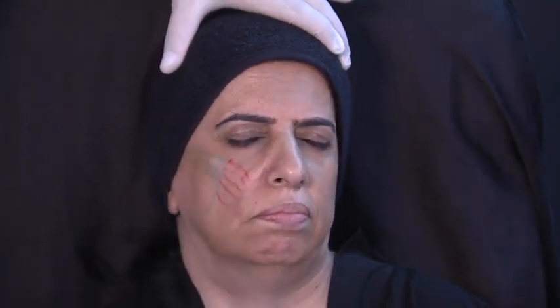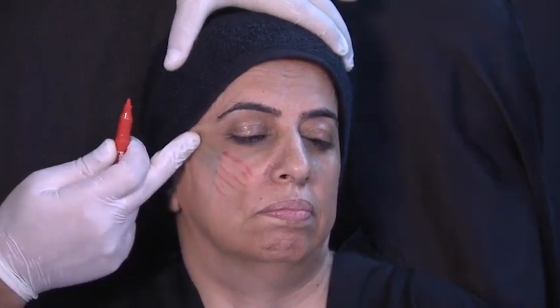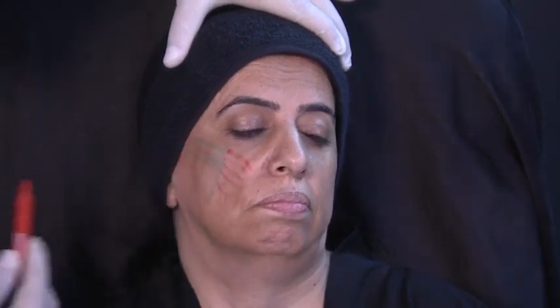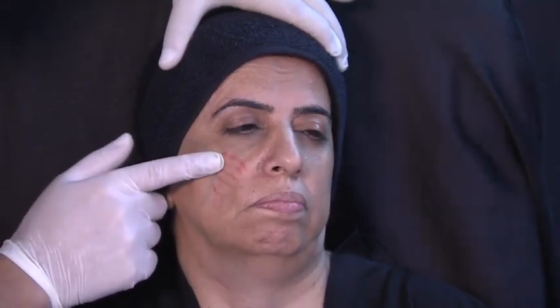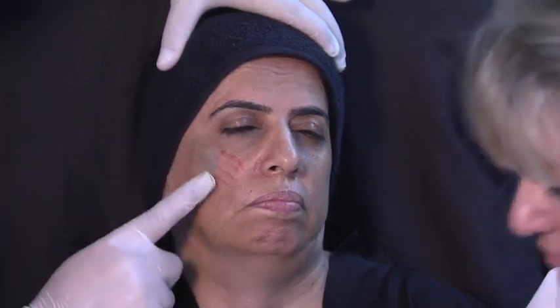I am going to use one product for the lifting and projection area. Projection, lifting, this is one product. I'm going to use another product for the volumization area. Okay, we agree with this. She needs volume here, she needs projection and lifting here.